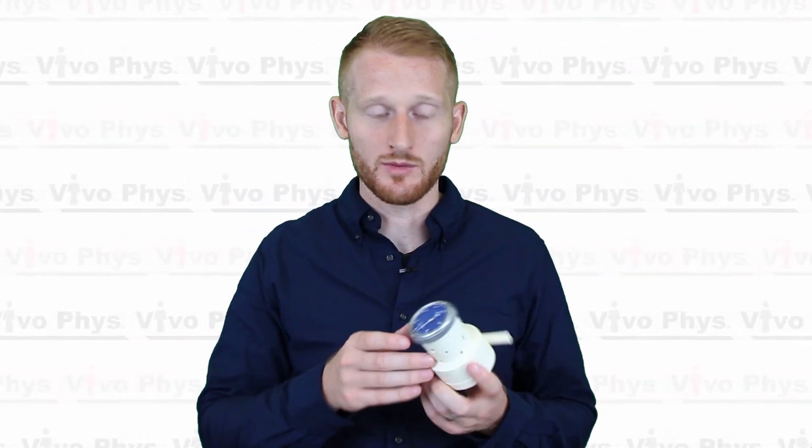This is used to measure total lung volume, or at least the volume that you can blow out, and it's very simple to use and also fairly inexpensive.